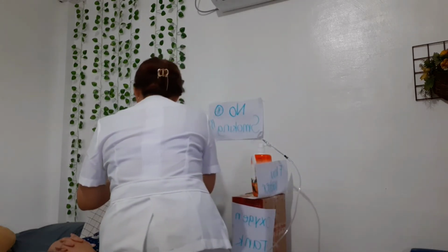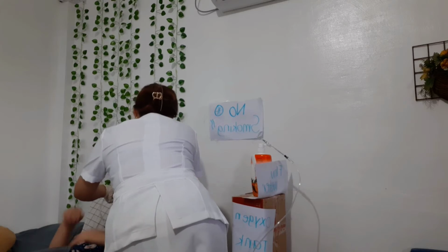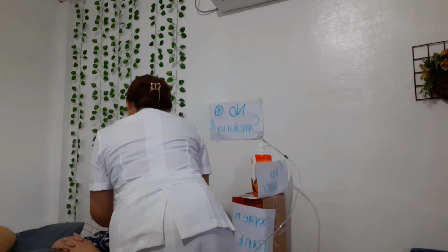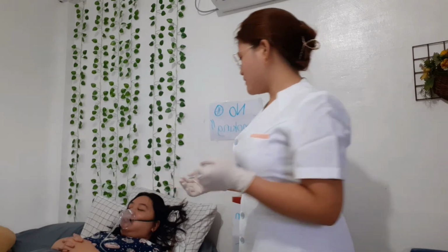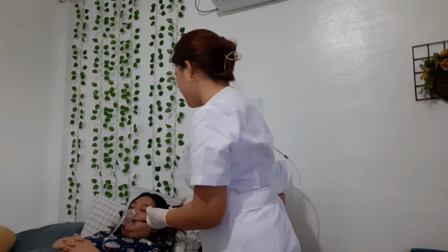So ma'am, may I put it in your... So of course, also you need to ask if the patient is comfortable with the face tent and face mask. So ma'am, komportable po ba kayo? Okay lang po ba? Hindi po ba masikip? Okay.